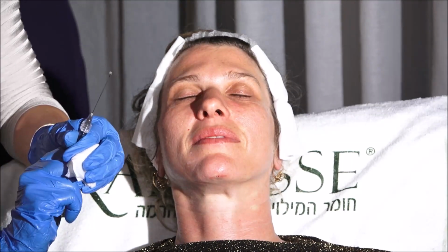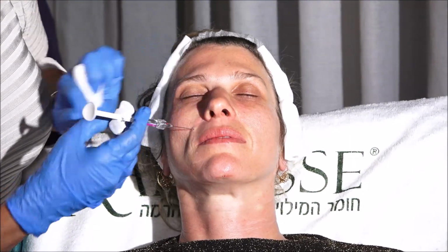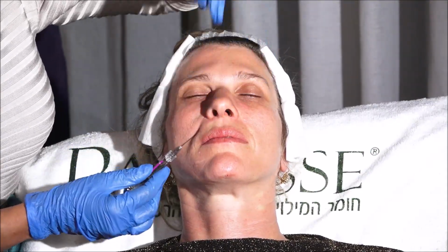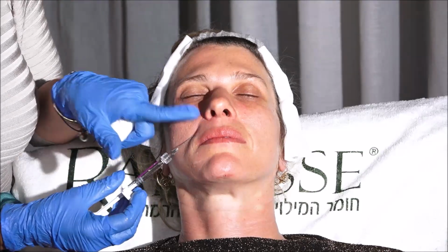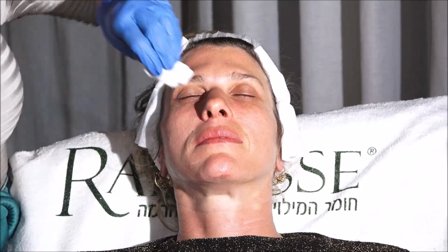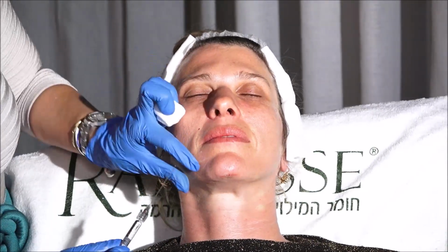Okay. Now we're going to get a 50 millimeter 22 gauge cannula with the Belotero Volume, and we're going to give the injection. So I'm deep here, almost in the maxilla, and I'm directing to the nose. I am touching the middle of the ala, and I'm going to give a bolus of 0.1 or 0.2, retract to go in the middle, and give another bolus of 0.1. This is my correction to her fossa. I'm not going to do anything else.